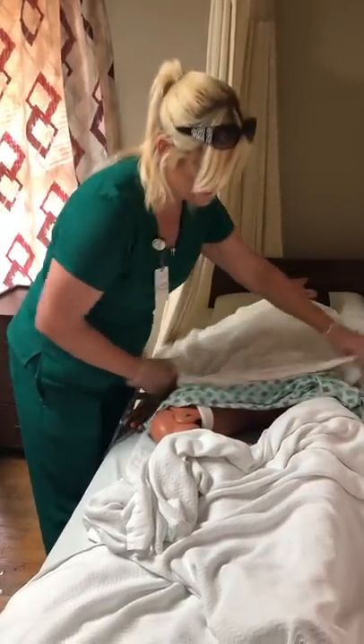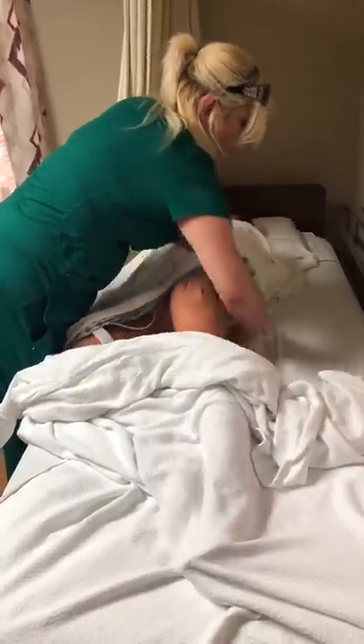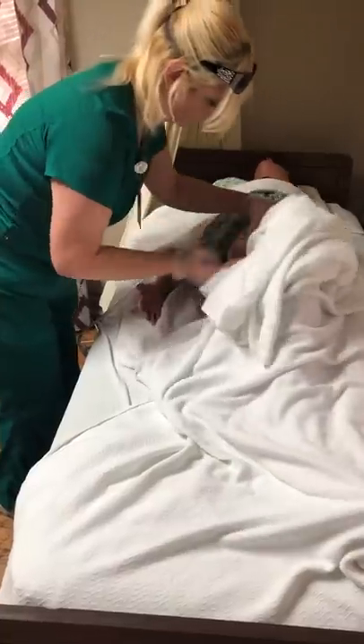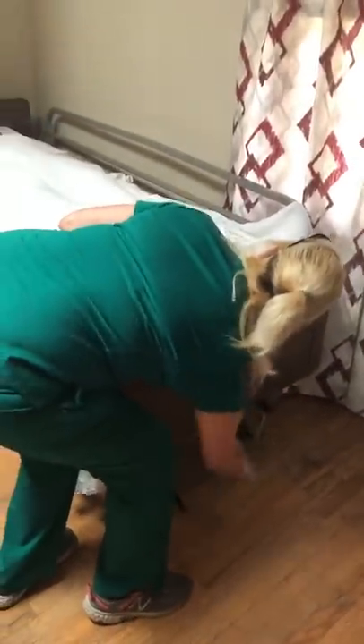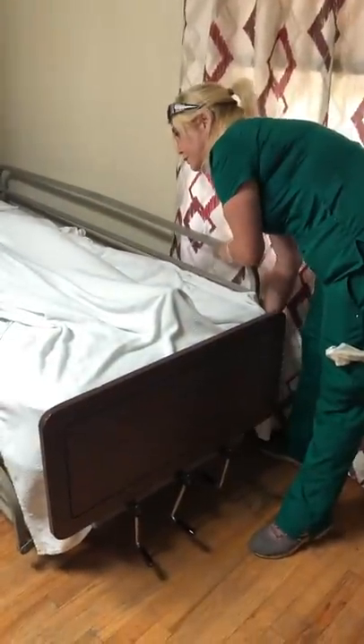Cover them up to provide for their privacy. I'm going to roll them towards me and tuck this waterproof pad back under them, then roll them away from me and remove it — that'll go in our dirty linens as well. Pull the other blanket and sheet up, remove our bath blanket. I'm going to go ahead and put the bed down so that the resident is in a safe position. Put this side rail down if you have utilized it.